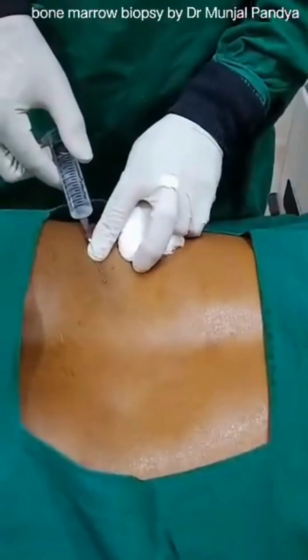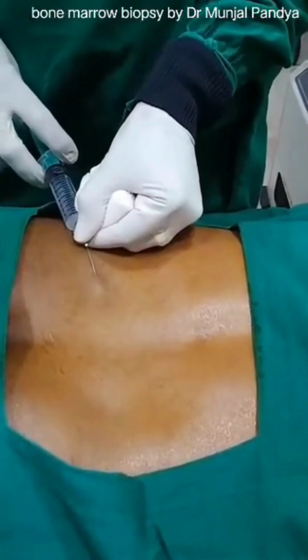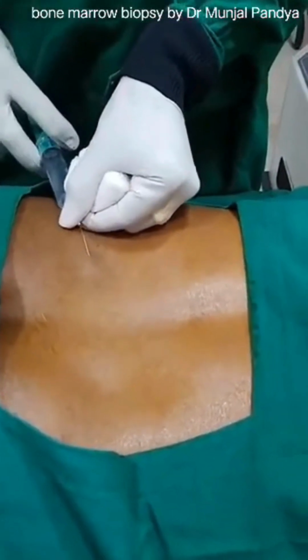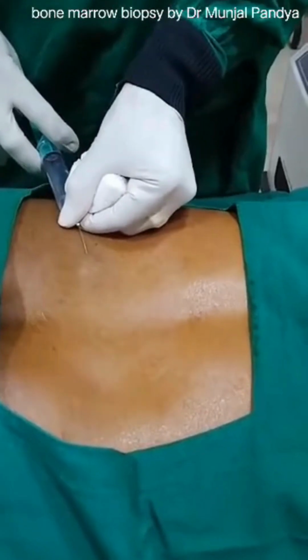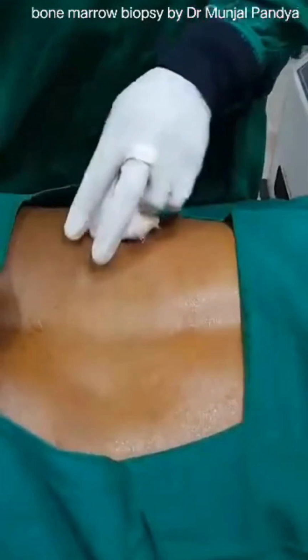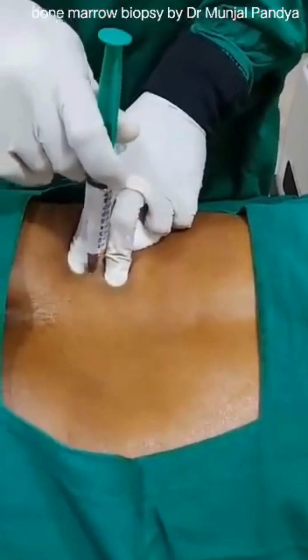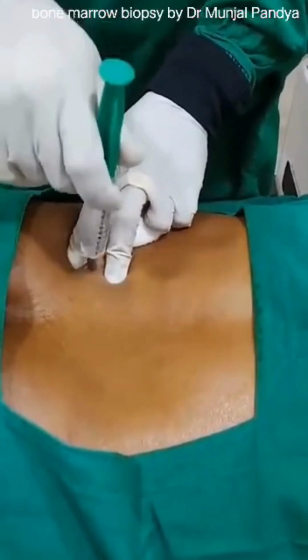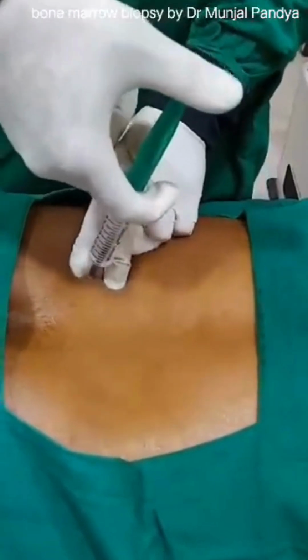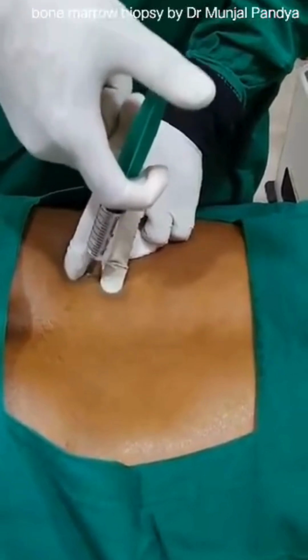So first I have to infiltrate the skin. Relax. Infiltrating the skin is very important, because all pain sensation goes from the skin to the nervous system. So giving good local anesthesia and infiltrating the skin with the 2% xylocaine is very important. After infiltrating the skin, you can go deep down to the posterior superior iliac spine. Right, so I have almost reached the posterior superior iliac spine. You can see my hand movement. I am giving it in different layers, in and out.